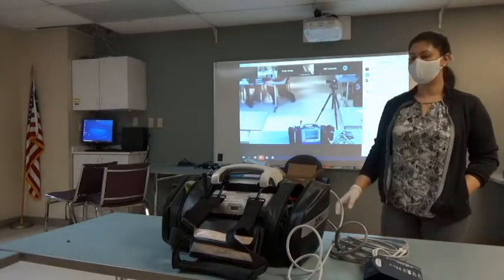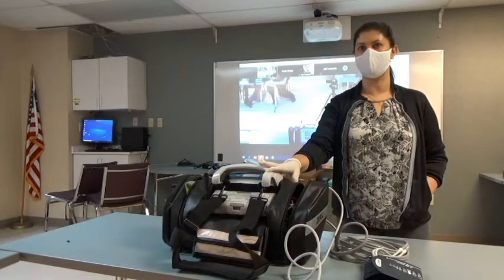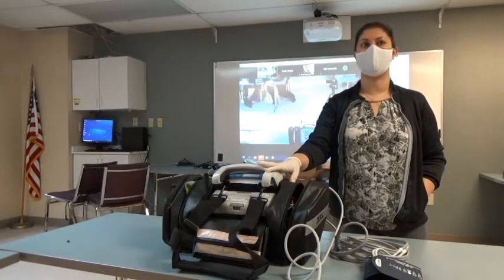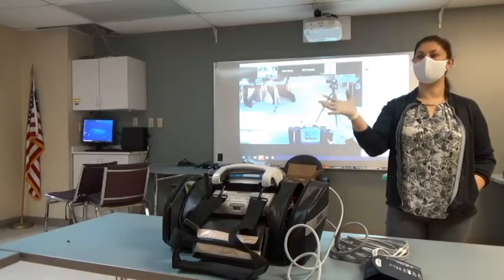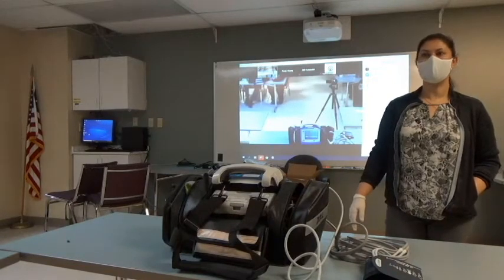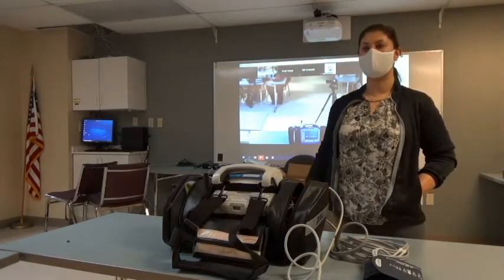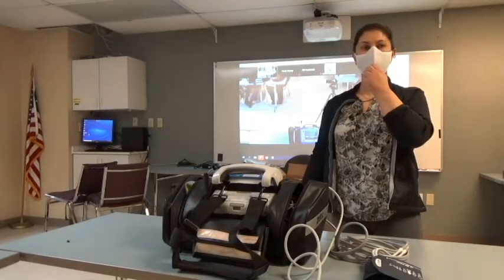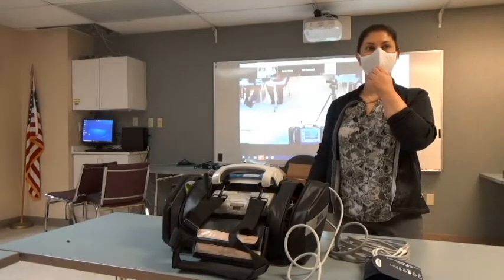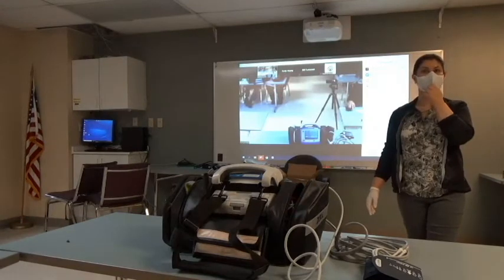We just have energy and we're done on this device. Is everybody that has a rhythm generator hooked into their rhythm generator with their defib cable? If you want to share with each other, you're welcome to do so. We're going to go through the AED first. On your rhythm generator, find the V-fib button. V-fib is the top row, should be the first button on the rhythm generator. Press the analyze button and follow the directions, and you can deliver the full charge.